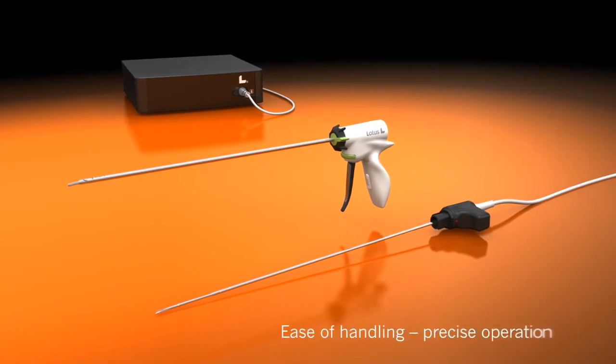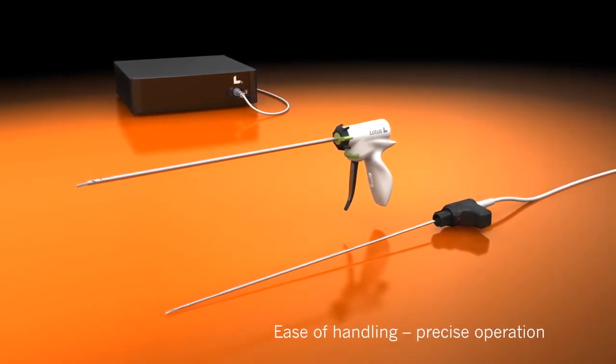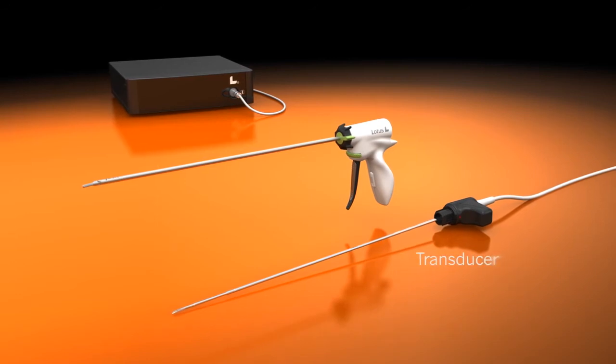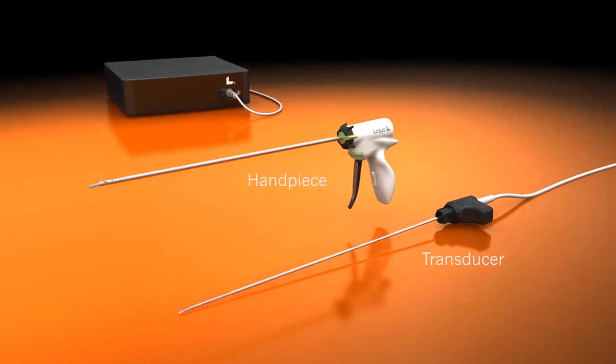The Lotus system stands out with its ease of handling allowing precise operating. The transducer is simply pushed onto the handpiece.